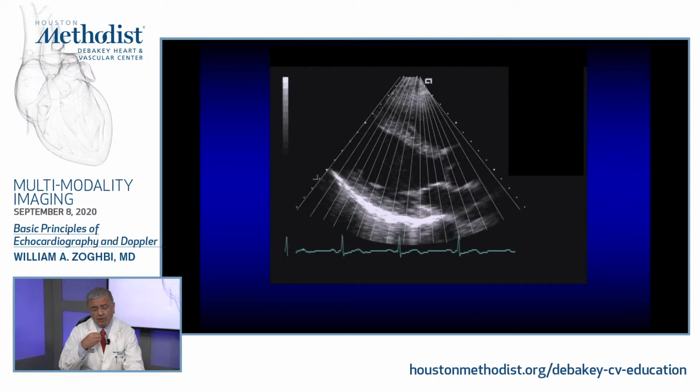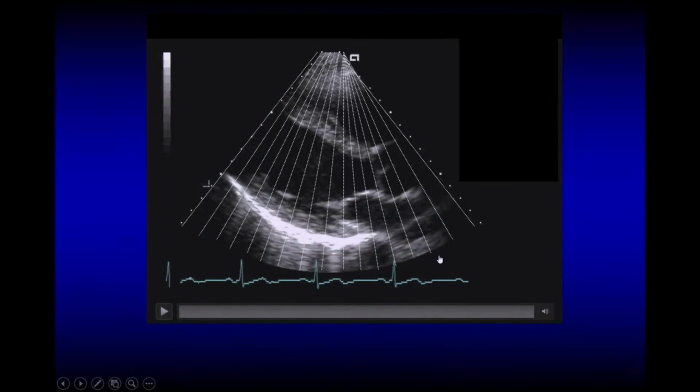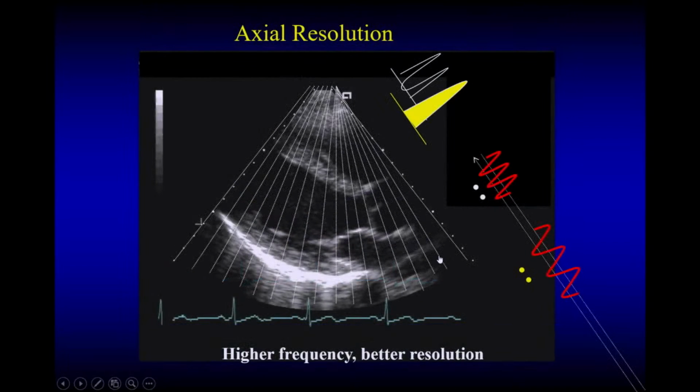So for echocardiography, it is more of a V-shaped scan as opposed to linear, where in the other parts of the body we don't have much interpolation of other areas that reflect too much ultrasound. Notice also that they spread further. If you go further down, they'll spread further, and this is part of the issue of the lateral resolution that occurs with this kind of scanning.